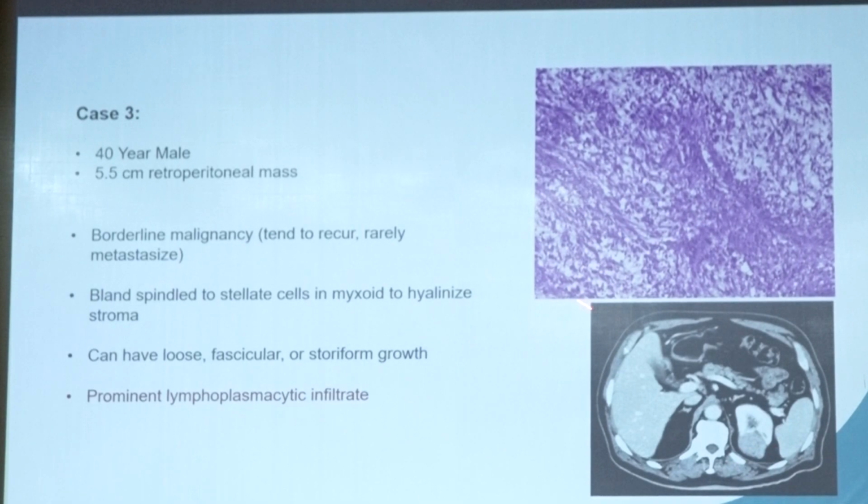And this lesion looked quite busy. If I had to tell what this tumor is showing, I would say this is the myxoid area, because it is looking more clear, more edematous or whitish. We have a cellular area, and then we have many interspersed lymphoplasmacytic cells. This tumor also shows eosinophils. Maybe it will also show you some giant cells.